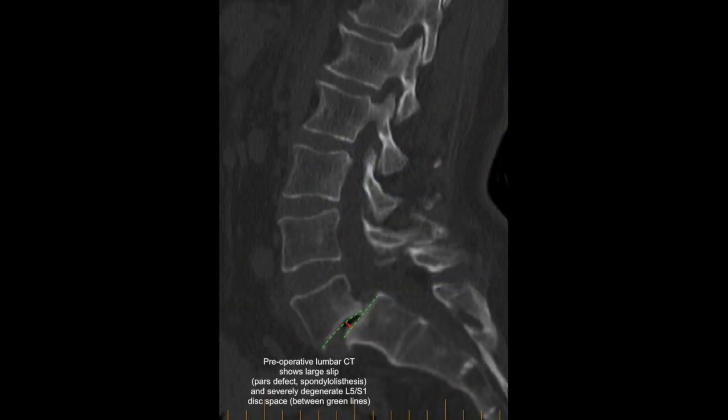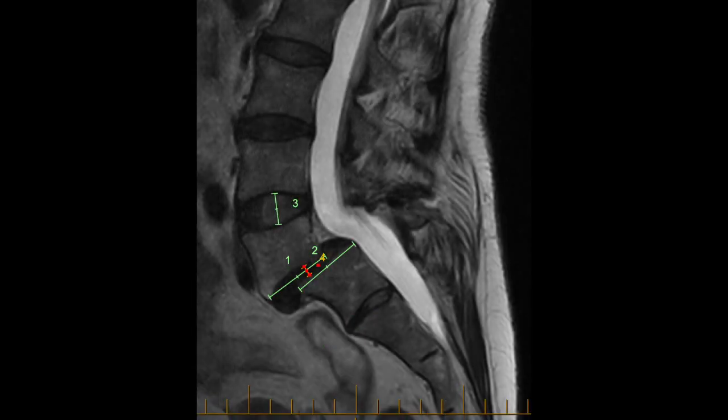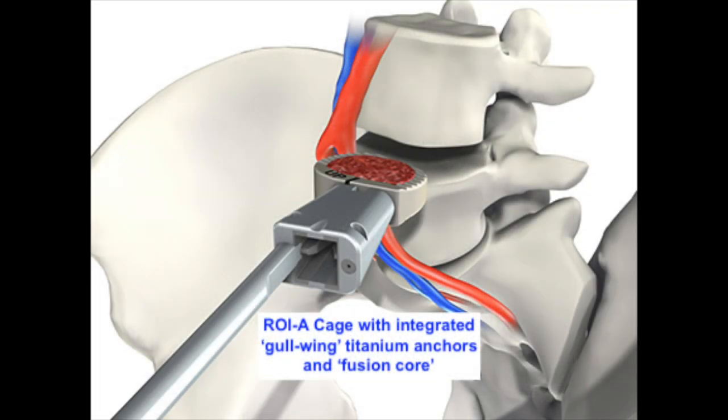This lady's case is a wonderful example of reconstruction of a lumbosacral junction that has slipped and has a very severe loss of disc height. The reconstruction planned for her was two stages on the same day. The first stage was through an incision in the tummy to put a cage in with an internal fusion core between the slipped vertebrae of L5 and S1.